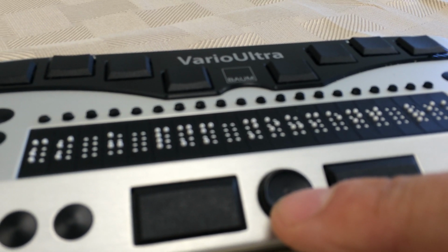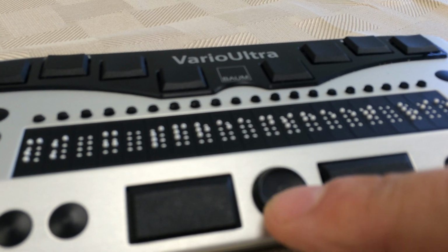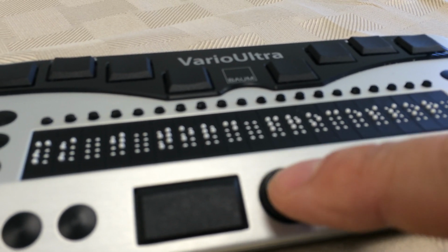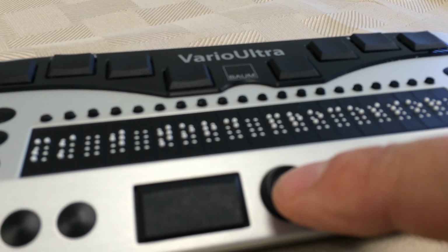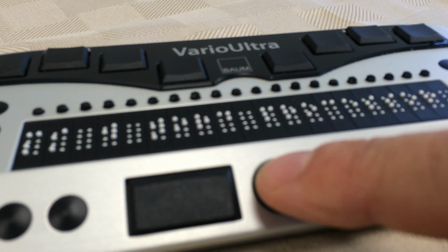So right now we're looking at the PDF viewer, and then we have the spreadsheet viewer, and so on and so forth. I can also go up if I want to, and if you do come across something that you want to activate, you can simply press down into the middle of the Navi stick and use it almost like an enter key.